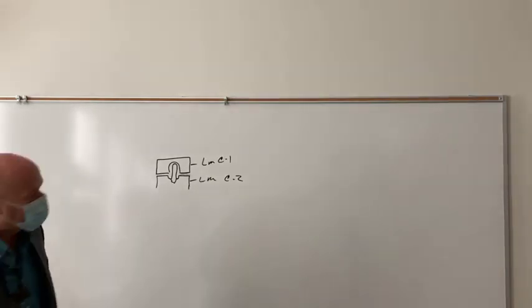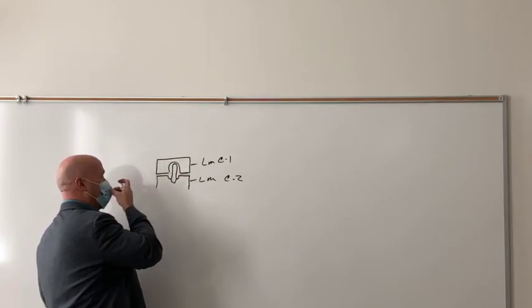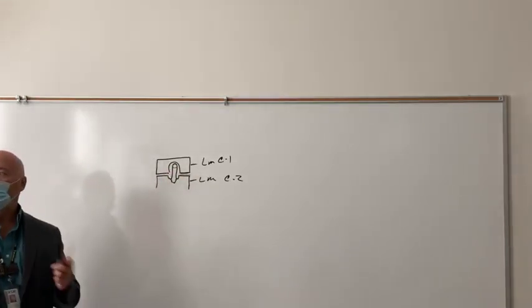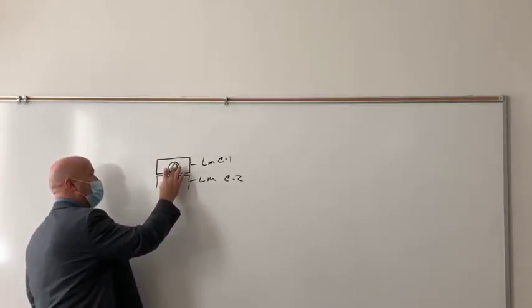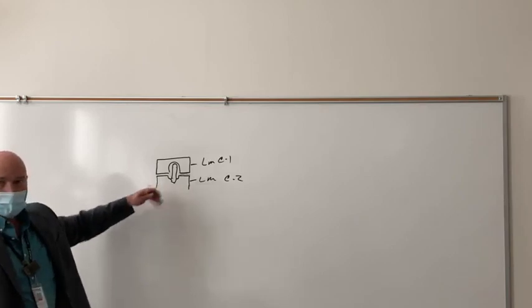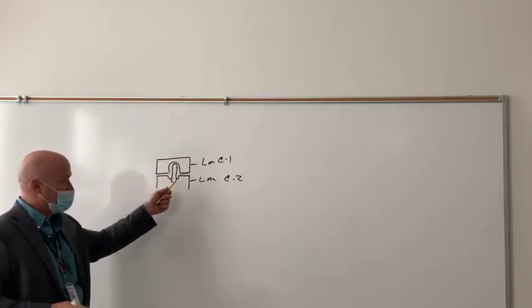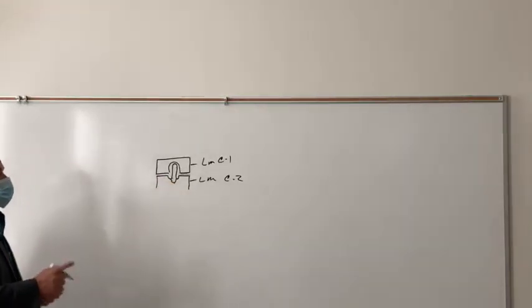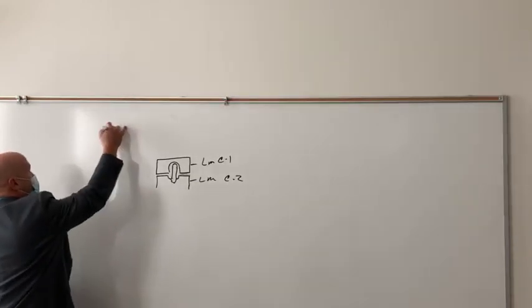So the odontoid process, you do have some fractures of the very upper portion of the odontoid process occasionally. Most of your odontoid fractures are going to be at the base of the odontoid. So most of the fracture is going to be way down at the bottom for the same reason. If it's going to break, it's going to break where it's least flexible, so to speak. Okay? So we're going to look for those.